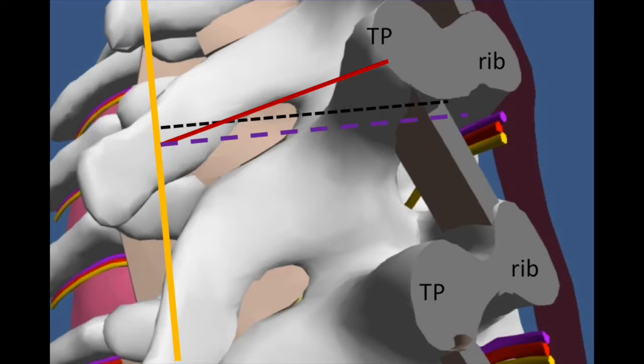Needle entry point is a few millimeters below the skin projection of the caudate edge of TP, shown by the black dashed line. Red represents safe landing on TP. Purple represents advancement into TPVS after contact with TP. The final needle angle when the needle tip is in the TPVS, which is the purple dashed line, should be close to a right angle with the surface, or just slightly more caudate, about 10 to 20 degrees.